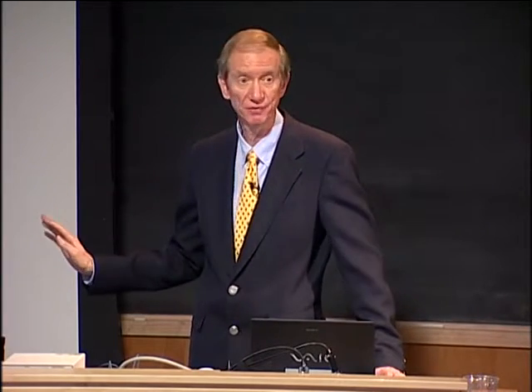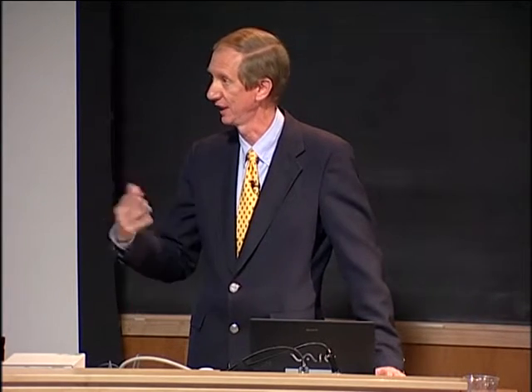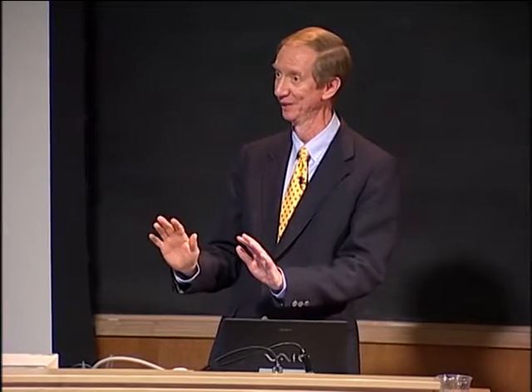So in the simplest version of this, all we're doing is blocking contact activation and adding calcium and seeing what happens. And you know what? If you're healthy, nothing happens. For 60 to 90 minutes, nothing happens. If you recalcify blood and have the contact system blocked in a healthy person, basically nothing happens. It makes sense. We really don't want your blood, which is full of calcium right now, to clot. I hate to tell you this, but you're all recalcified at the moment. And you don't really want clotting going on everywhere, right? And it shouldn't. And that's what happens in normals.